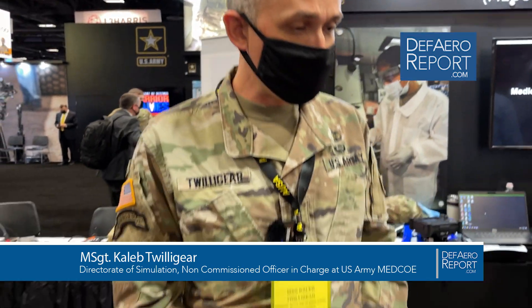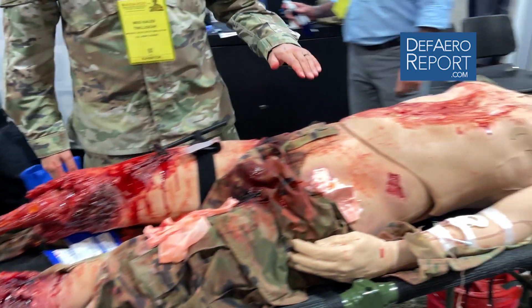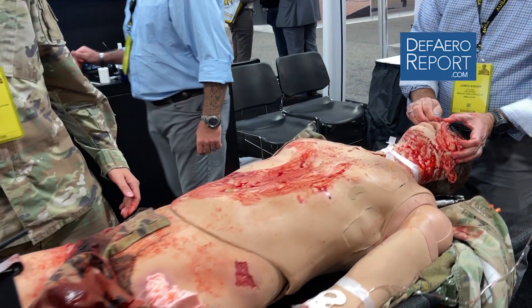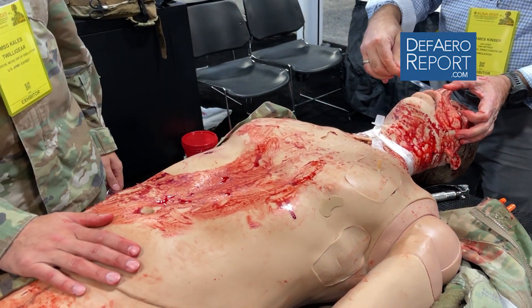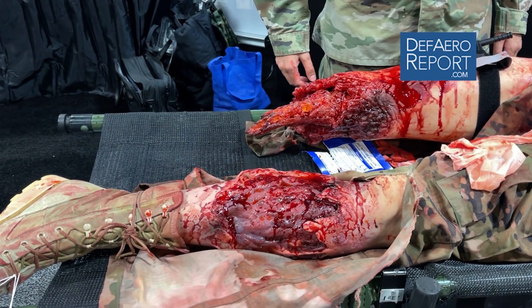I work for the Medical Center of Excellence at Fort Sam Houston, San Antonio, Texas. I'm here today demonstrating a training capability — not the mannequin, but what the mannequin is used for. This is a tool that we use for all service members to ensure that they can deal with the leading causes of preventable death on the battlefield.